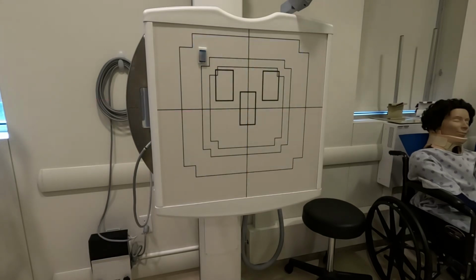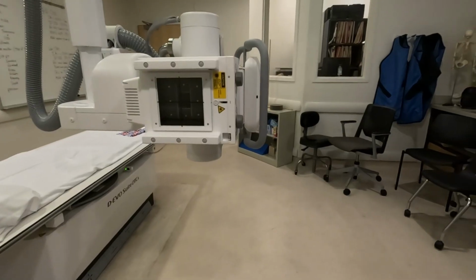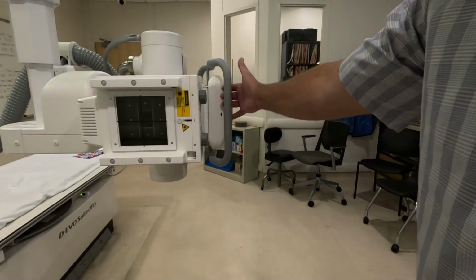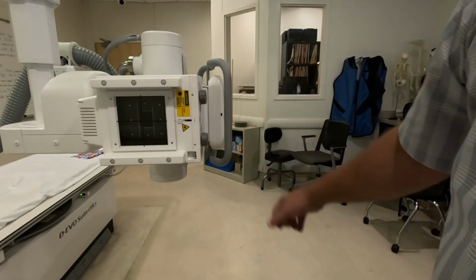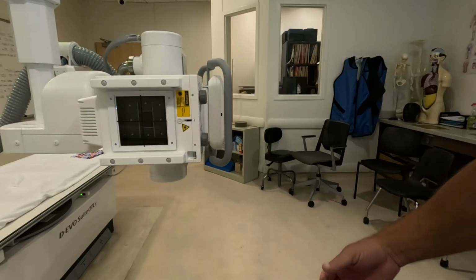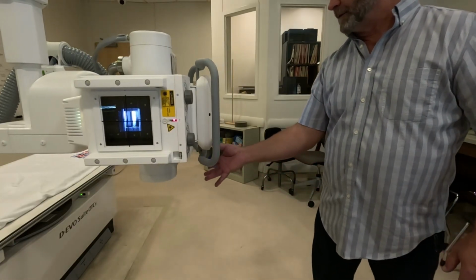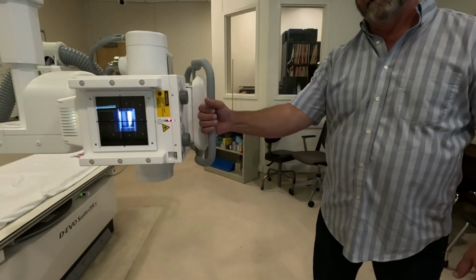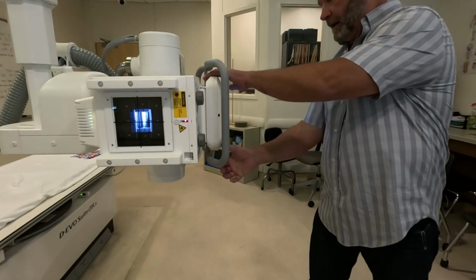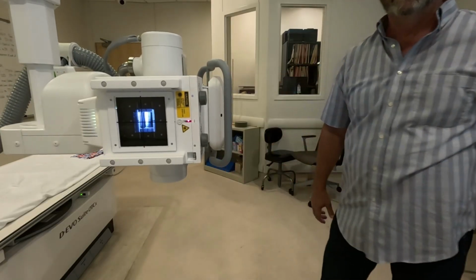What I was doing in this case, again, I'm still learning the machinery. In this case, what I was doing is I was pushing the button, but I was also holding on to this. If you have the everything button pressed, or if you're hanging onto the handle, it won't give you a detent. So we're kind of learning here together. So notice I'm not holding on to the handle. If I grab the handle, no detent. But if I've got the orange button pushed, it'll lock in, okay?